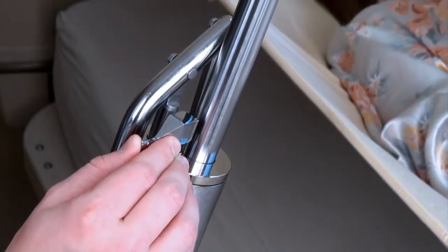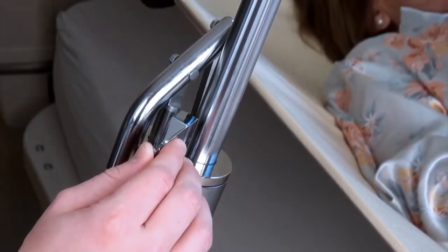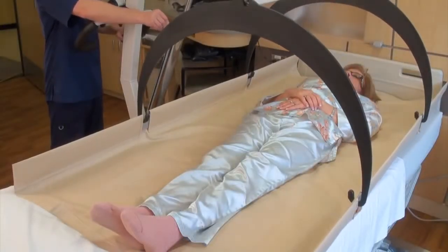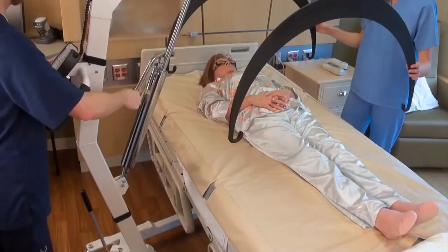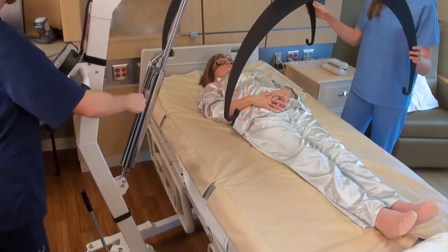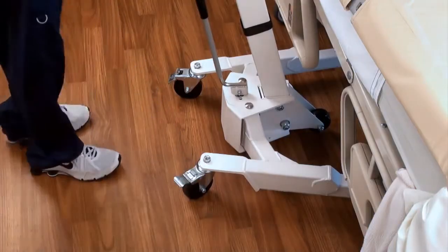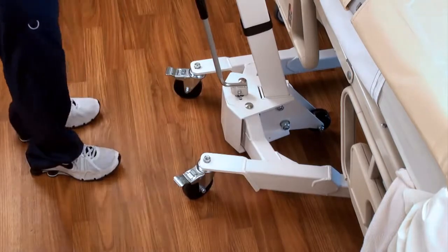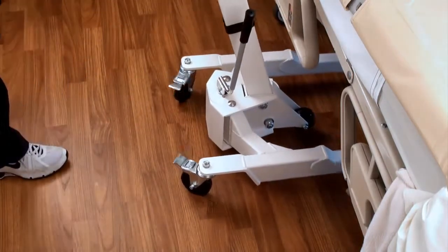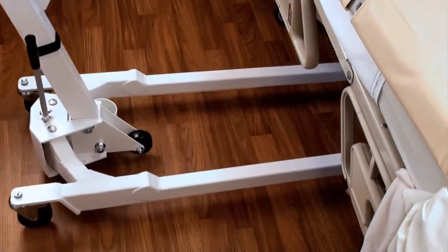Once the weight has been measured, lower the patient slowly to the bed by opening the release valve. When the patient is back on the bed, detach the stretcher support bars from the support hoops and raise the arm so that the hoops are clear and away from the patient. Unlock the wheel brakes and set the stance to narrow once more using the stance adjustment handle on the base. Roll the scale away from the patient's bedside and chart the weight.